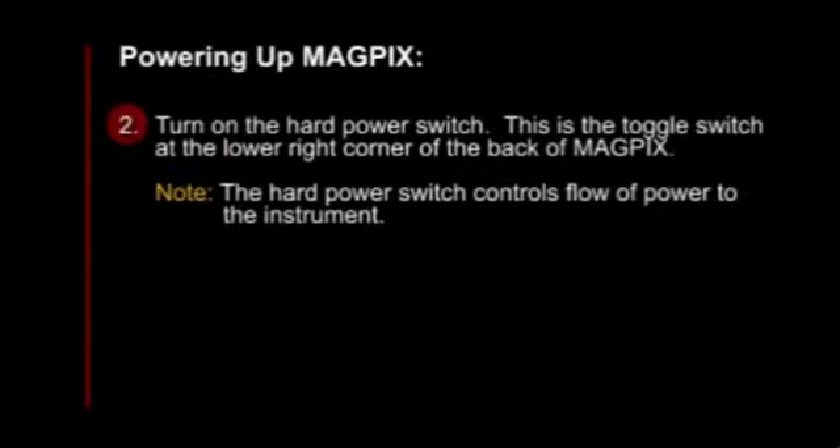Turn on the hard power switch. This is the toggle switch at the lower right corner of the back of MagPix. Please note, the hard power switch controls flow of power to the instrument.